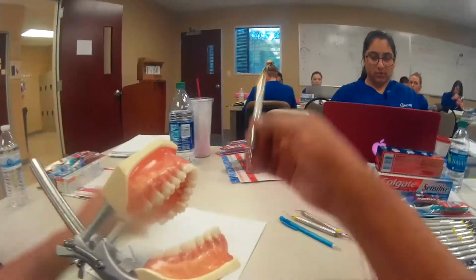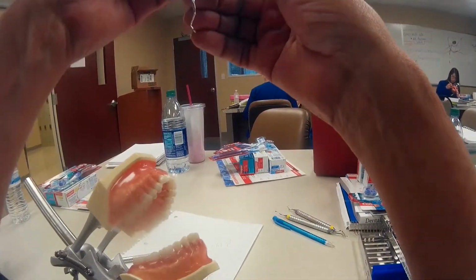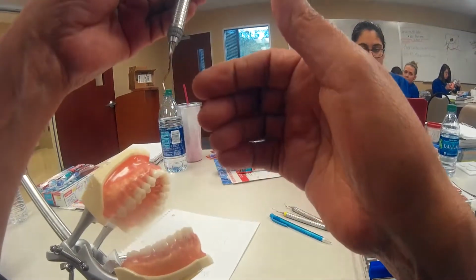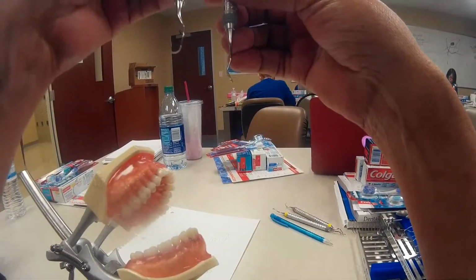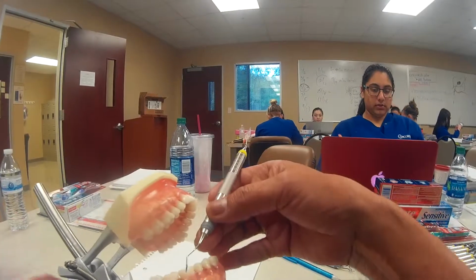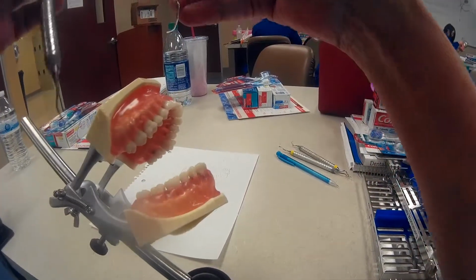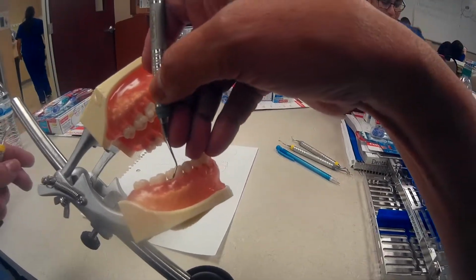Okay, so I'm going to pick up the next one by process of elimination. That's my mesial end. This is my distal end. I find my cutting edge. Sometimes you've got to look at both of them to make an accurate determination. Okay, so here's my cutting edge on this side. Okay, and if I try this one, I'll find that my cutting edge is not able to be adapted, because I'm staring at it right in the face.